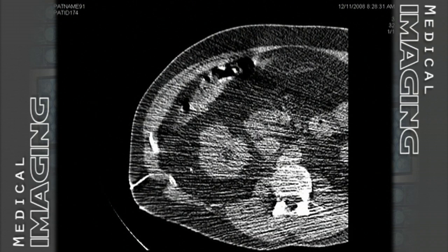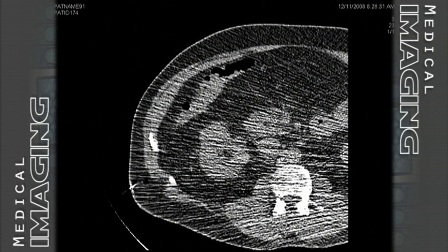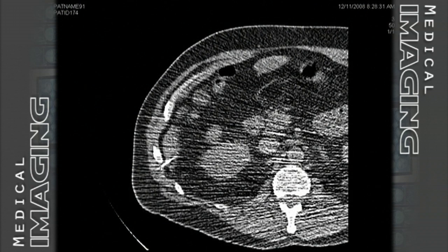The streaking artifact that you see is introduced because of instrumentation on the patient's left side. Now you're starting to see the introduction of the first set of probes here in the lower part. Here is the needle passing between the ribs on its way to the area of suspected mass.